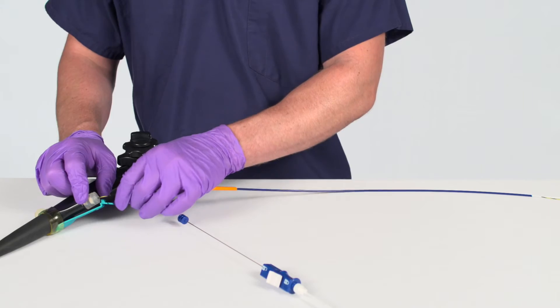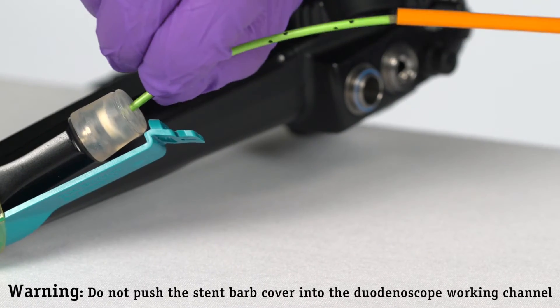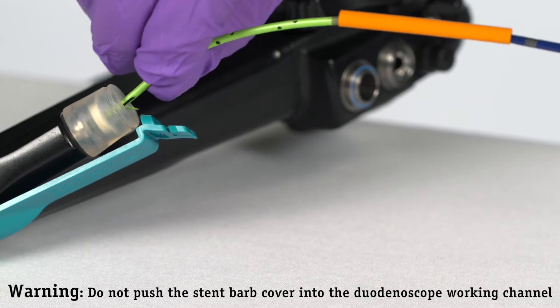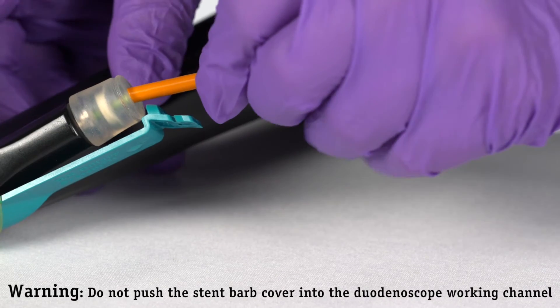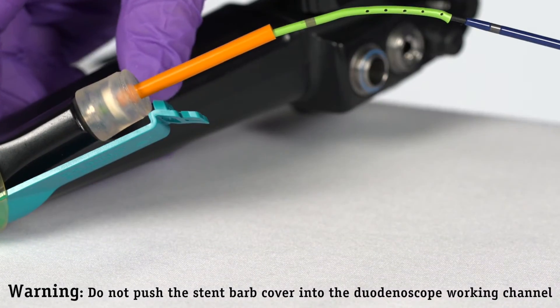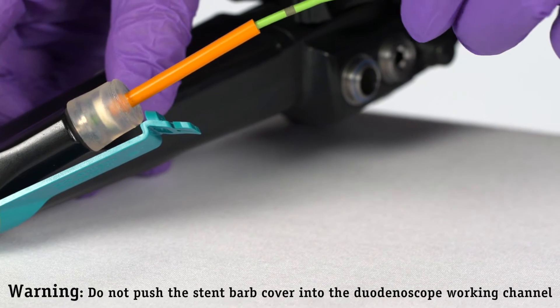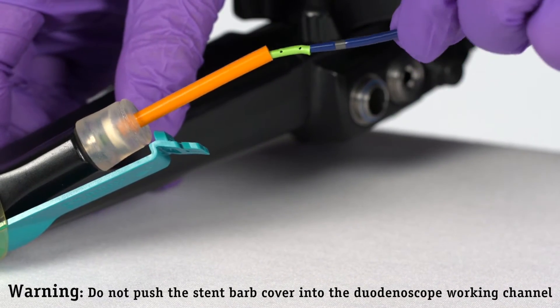Unlock the guide wire from the RX Locking Device. Advance the delivery system using the standard exchange method and insert the tapered tip of the guide catheter into the biopsy cap attached to the duodenoscope. Slide the stent barb cover securely into the biopsy cap to assist with stent introduction into the biopsy cap attached to the duodenoscope.